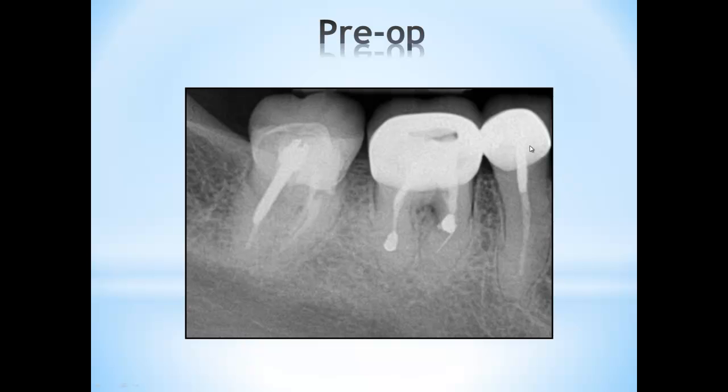The lady has secondary cavities under long-lasting restorations number 29 and number 30. So we have to change those crowns. They are connected with each other. That's why I started this case and prepped 29, 30, and 31 at the same time.